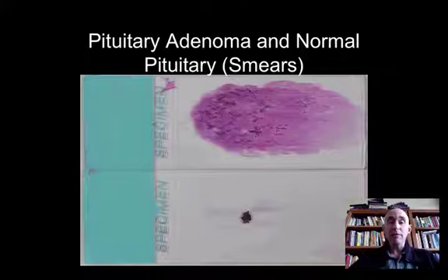On the bottom, conversely, anterior pituitary doesn't like to surrender its cells, so you get almost none of that. You've just got this dense little area where if you focused up and down, you'd be able to see adenohypophyseal cells. There'd be some heterogeneity to them. They're not the lush, rich, discohesive population that's seen in pituitary adenoma.